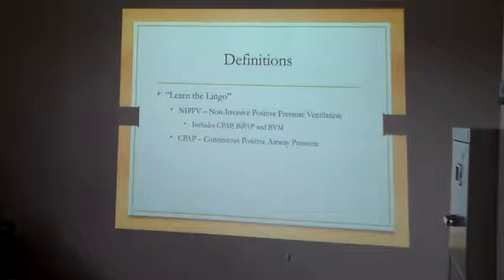CPAP is continuous positive airway pressure, okay? What this means for us is we're going to be using it at one consistent pressure, so one consistent pressure all the time. CPAP is what we use in the field, all right?